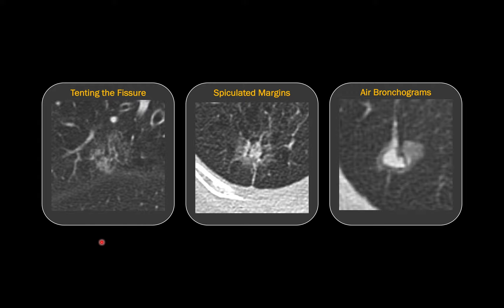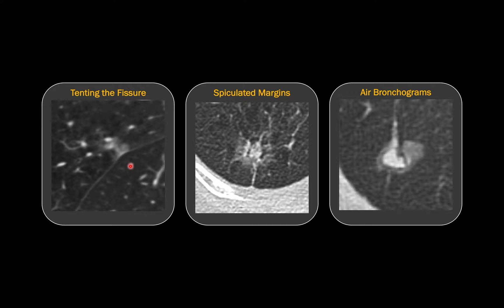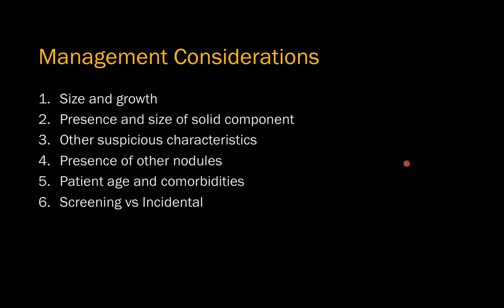A few features increase suspicion for cancer. One is tenting of the fissure — easier to appreciate on sagittal images. Spiculated margins also make a lesion more suspicious for cancer, as does the presence of air bronchograms. These features, along with size and the solid component, factor into the overall assessment.